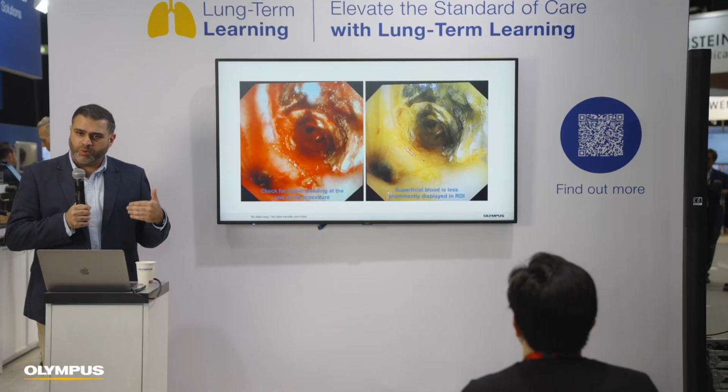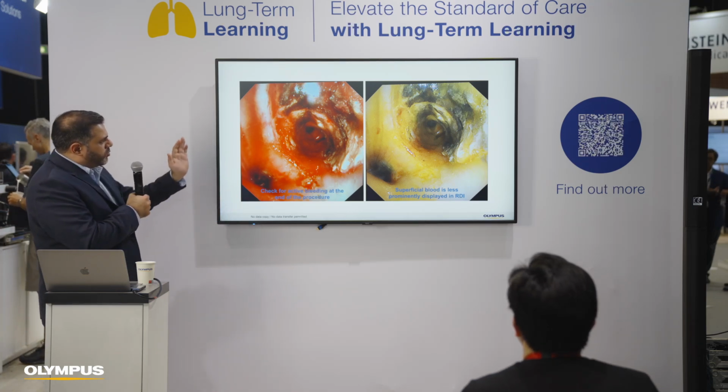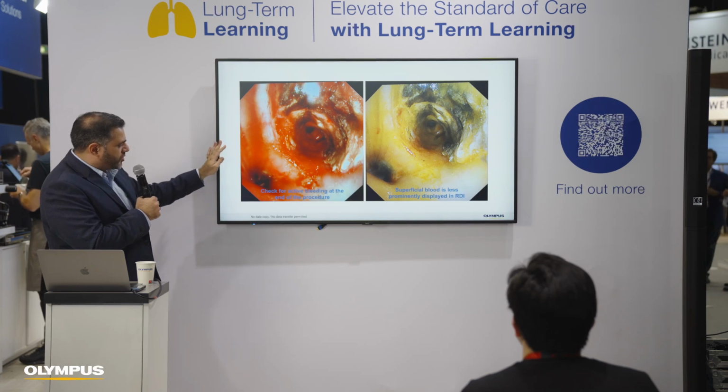Now, in this patient, we went on to debulk and laser ablate the tumor. And so we restored patency to the right main bronchus.